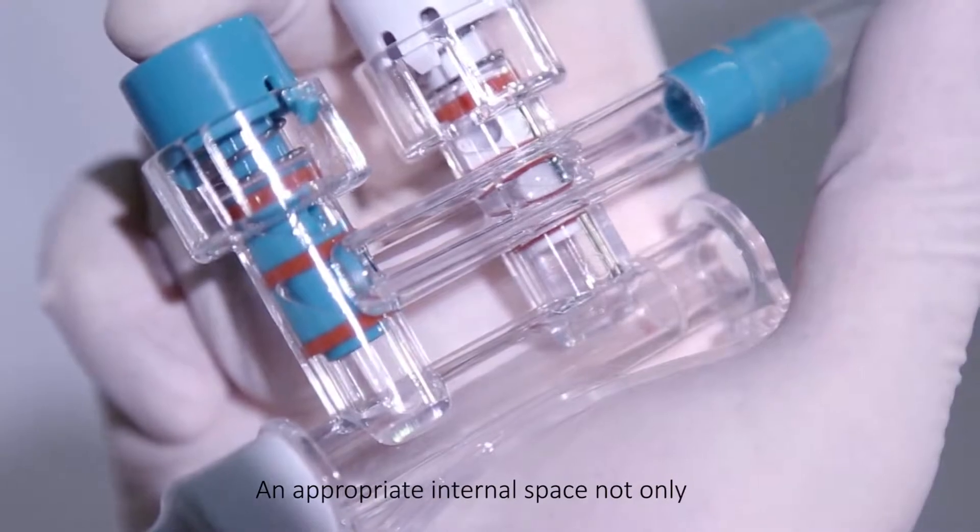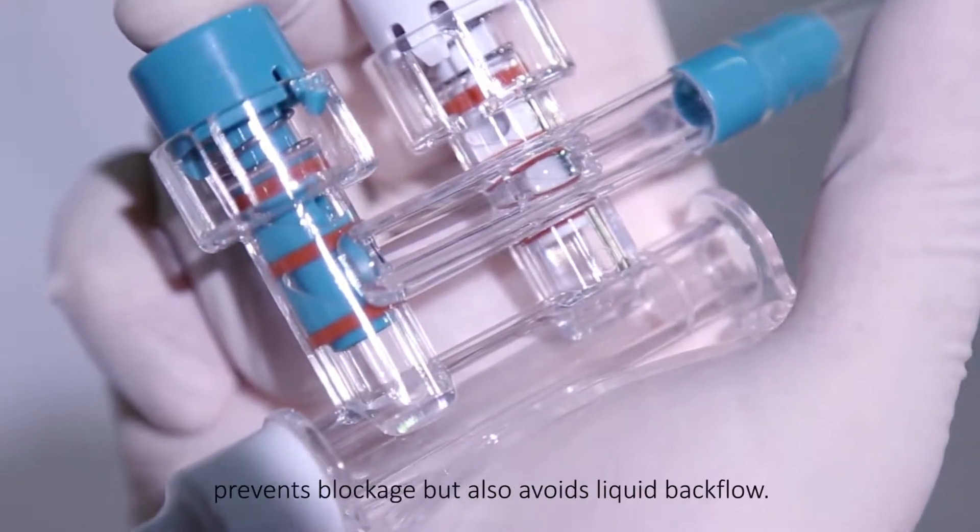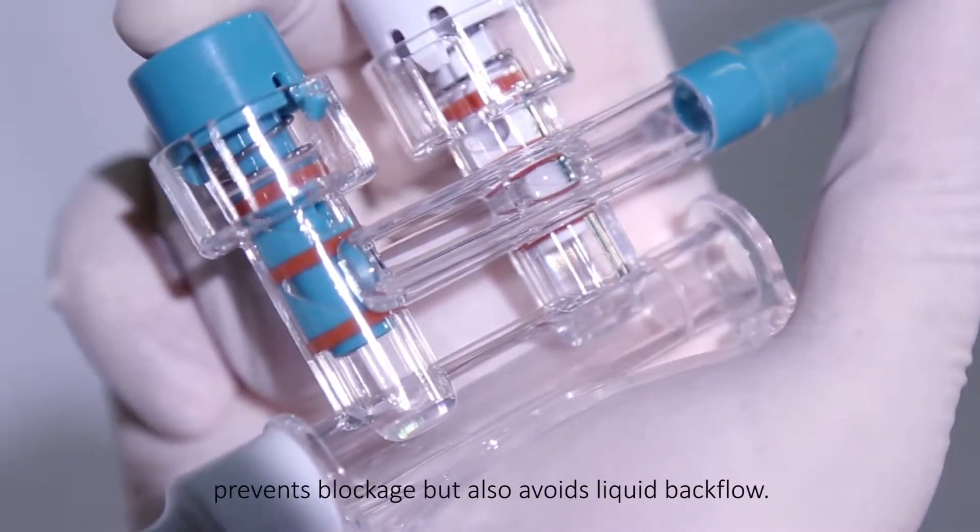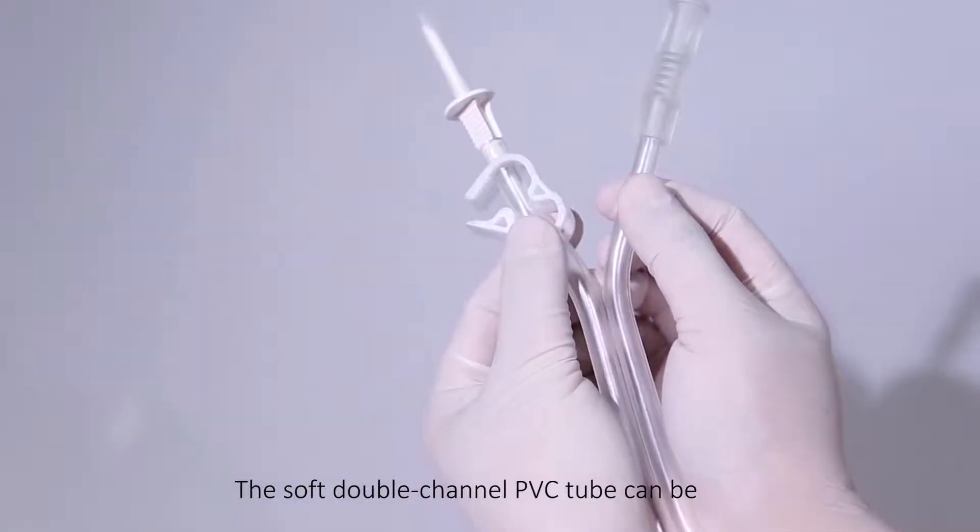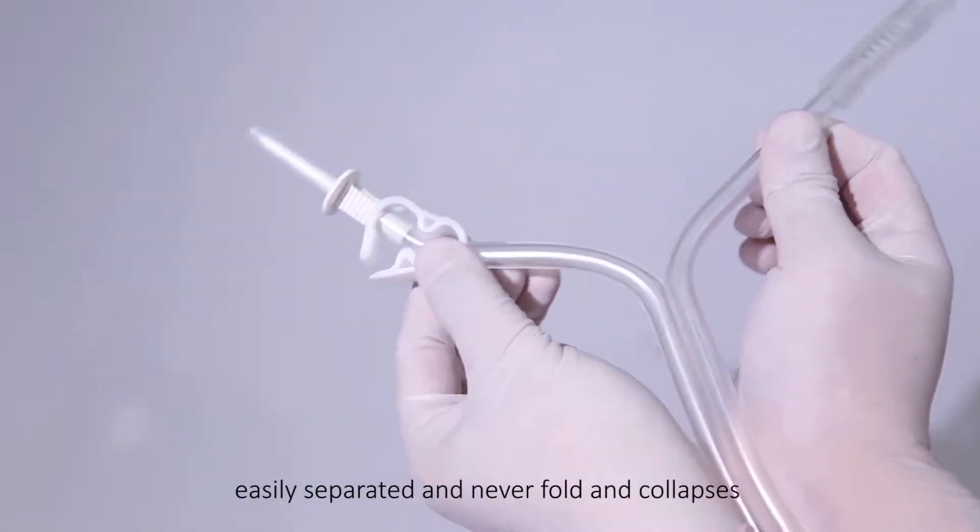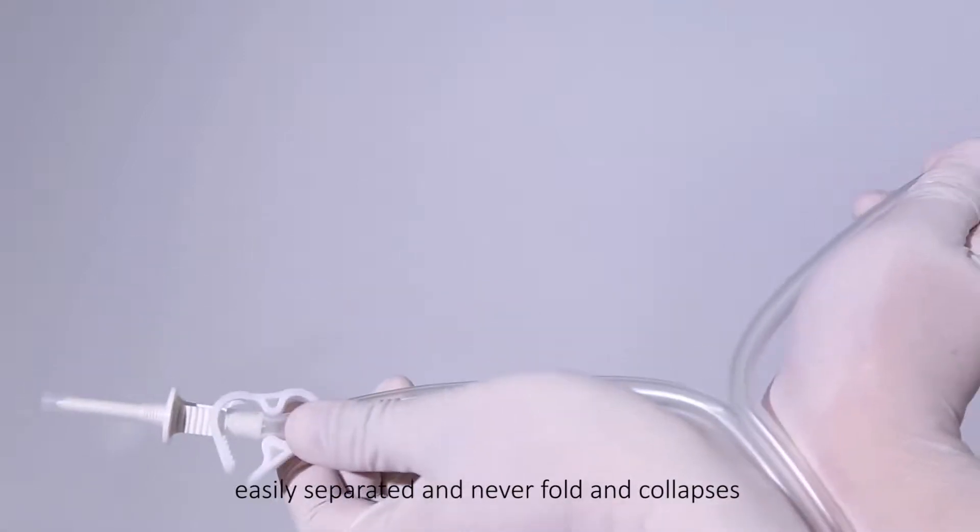An appropriate internal space not only prevents blockage, but also avoids liquid backflow. The soft double-channel PVC tube can easily be separated and never folds or collapses.